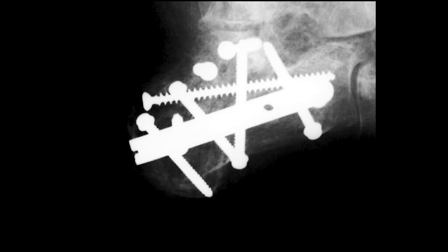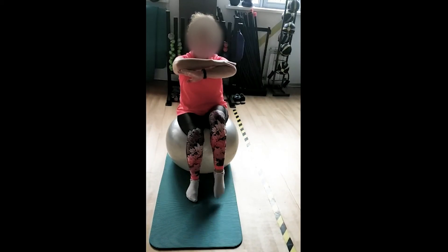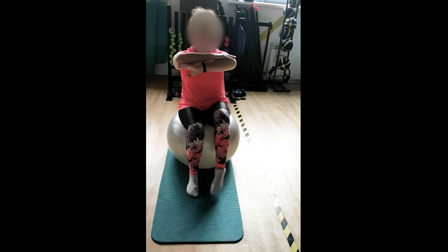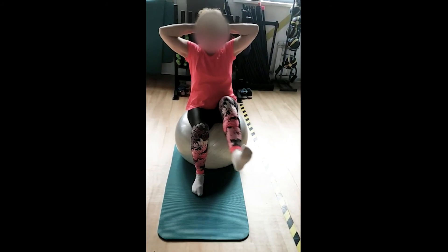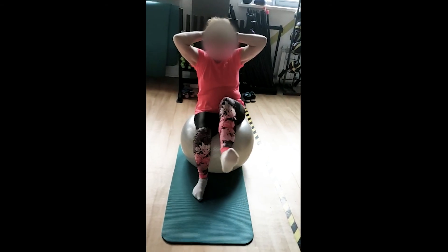The patient fully recovered her activity to the level before the trauma. Watching this video, please pay attention to the range of inversion and eversion of the left foot, and balance recovery as well.